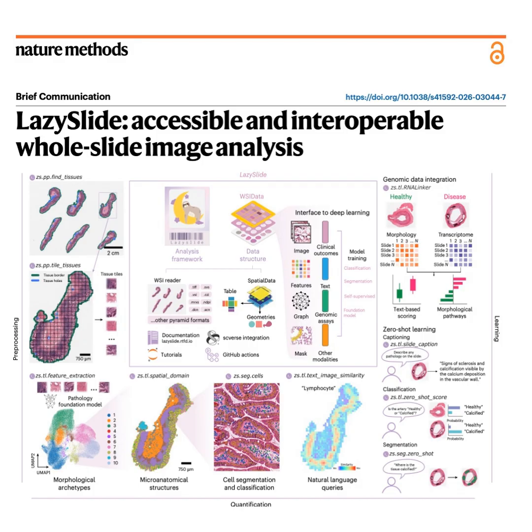But wait, I have to challenge you on something here. Okay, what's the issue? If you chop a continuous piece of tissue into a strict grid of tiles, what happens to a cell that is sitting right on the border of two tiles? Doesn't the tiling process literally slice it in half? It absolutely does. And that introduces a severe spatial artifact. Because when the algorithm tries to count the cells later, it's going to see two separate, weirdly shaped cells instead of one continuous cell.